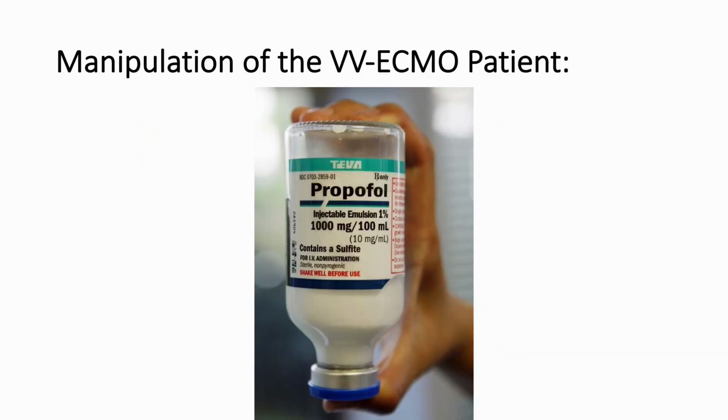Well, it turns out that sometimes there are certain management strategies and interventions that we can perform on VV-ECMO patients that can potentially improve oxygenation. In addition to the high likelihood of requiring sedation prior to initiation of ECMO, essentially all VV-ECMO patients will require sedation at some point during their management. Obvious is the need for sedation for the cannulation procedure itself, but the management of sedation for patients beyond this time is complicated, and the ideal strategy has not been determined as of the writing of this module.